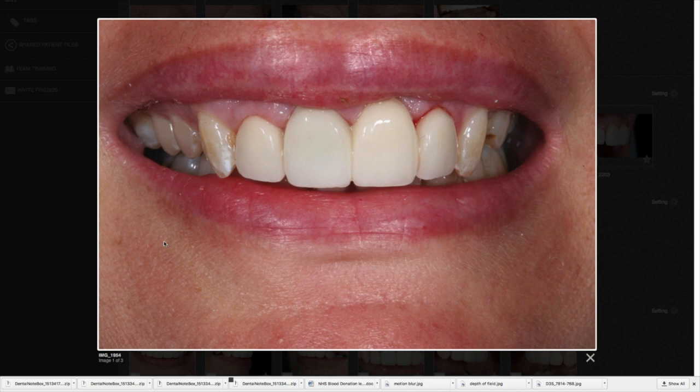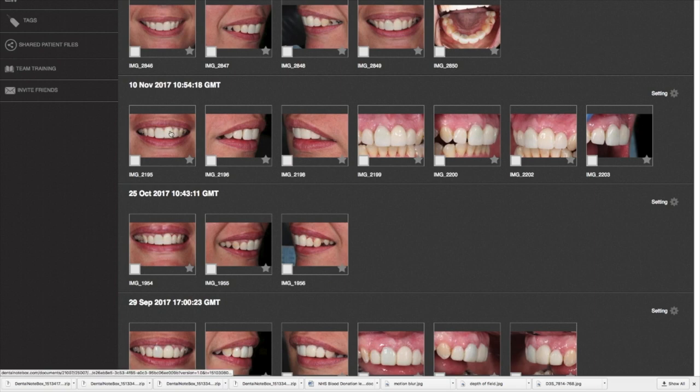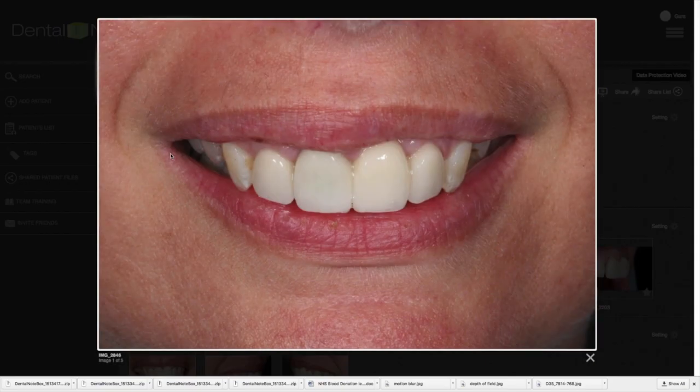These are the finals in position. I was a little bit concerned - remember, we've moved the underlying teeth, so it's a little bit risky. We need to get a removable retainer on there as quickly as possible. But I thought because we've got a bridge and both teeth are really well bonded into position, it's unlikely we'd get a lot of movement. We took an impression and a week or a few days later she came in and we've got a gap between the bridge and the single crown - it looks terrible. Because I had that original retainer made, I asked her to wear it religiously and kept my fingers crossed the gap would close. Luckily it did. A few days later she came in and the gap looks perfect - just like on the fit day, only the gums are a little bit nicer as well.